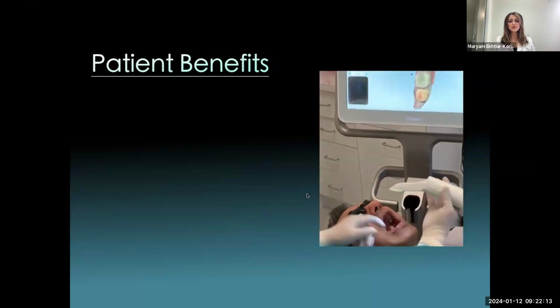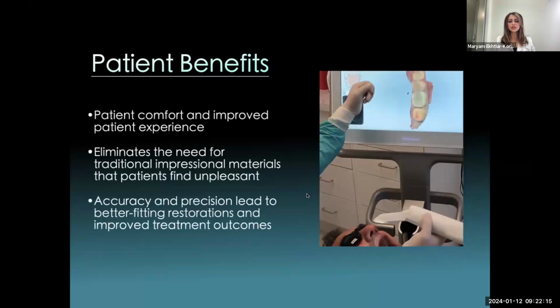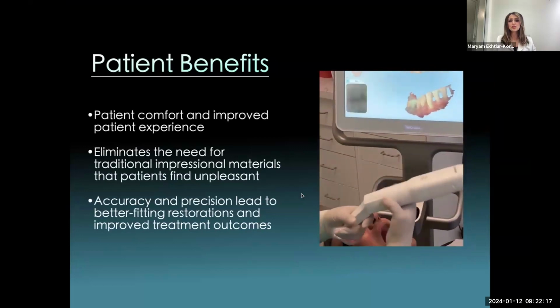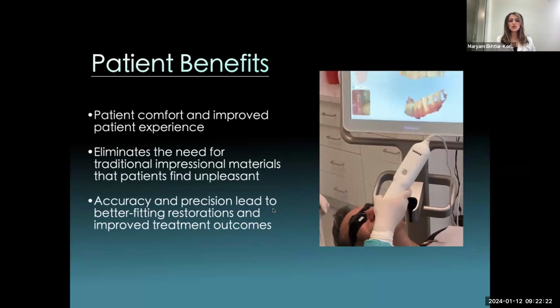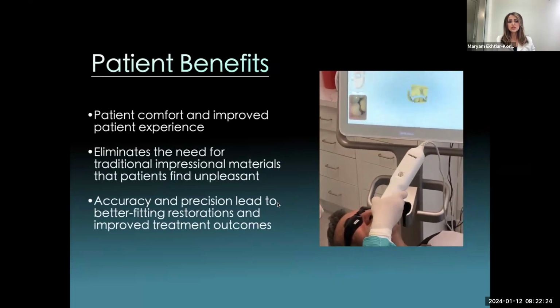So patient benefits of intraoral scanning include increased comfort and a better patient experience. You don't need the gooey, sticky impression materials that we used to use, and the accuracy and precision is much better.